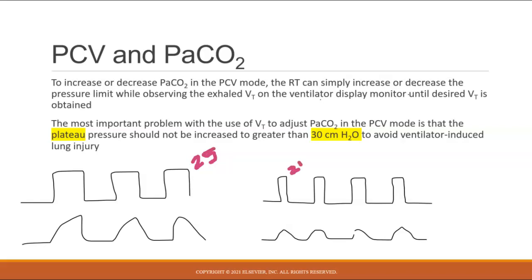So it's not just what my pressure gradient's set at that creates the volume in my patient, it's also that time. So here you see that I have a much longer I-time set, which is achieving a much bigger volume because I'm spending a longer time applying that pressure to the lungs. So I have more flow going in.